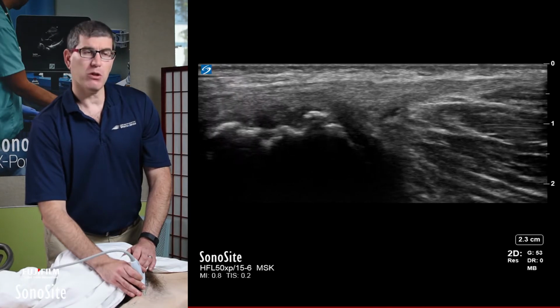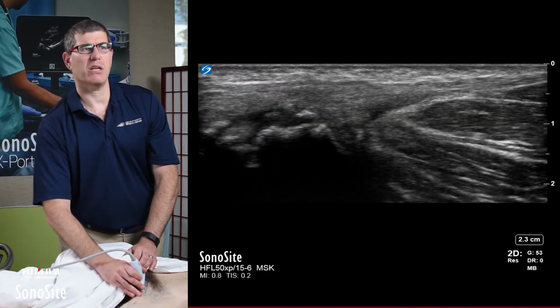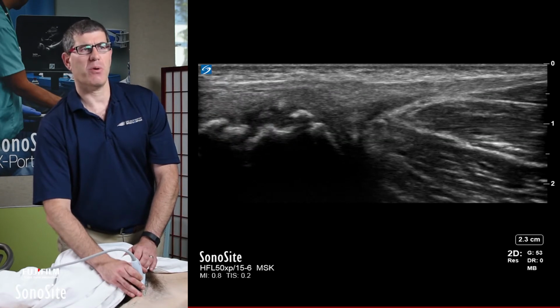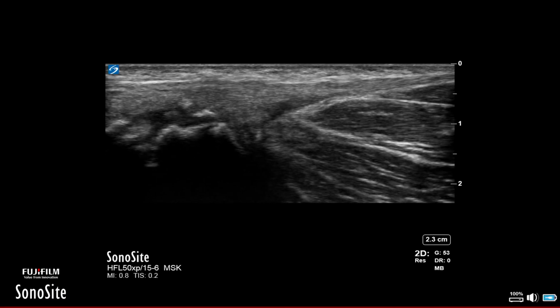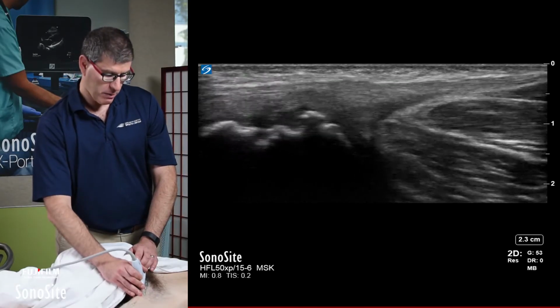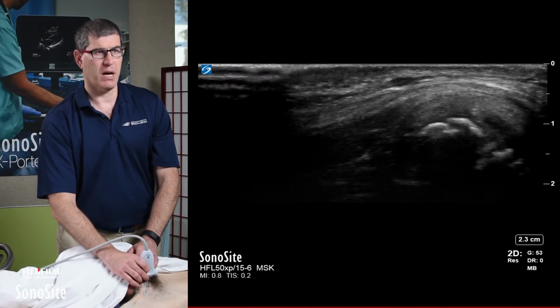Now, when I want to look at a sports hernia, what I want to think about is how the rectus abdominis and the adductor longus are really essentially part of the same muscle. To really understand that, what I'm going to do is now rotate to looking at the plane of the rectus abdominis. So I'm going to be rotating the probe into a long axis view on the rectus abdominis.